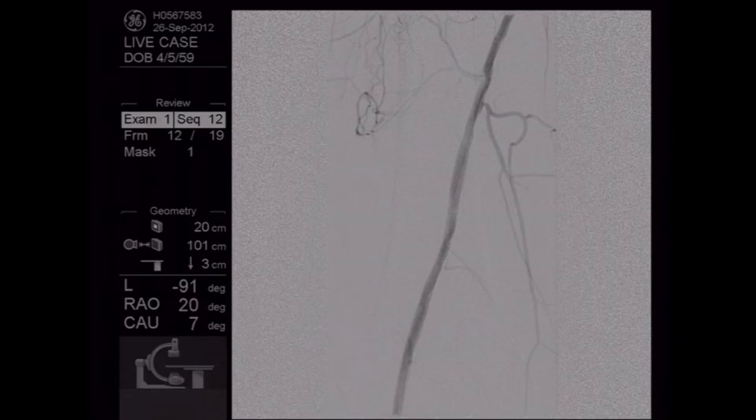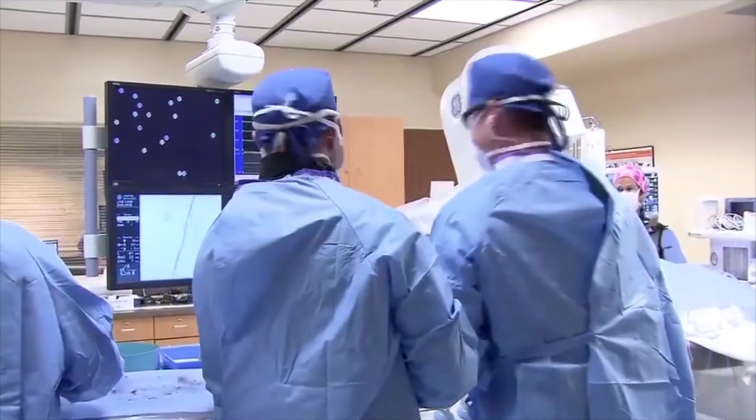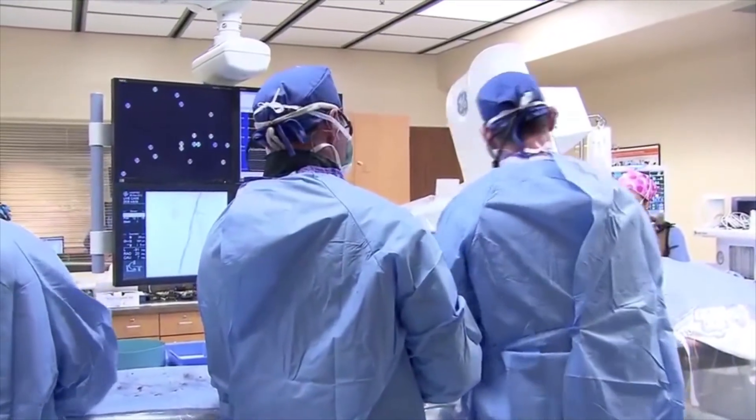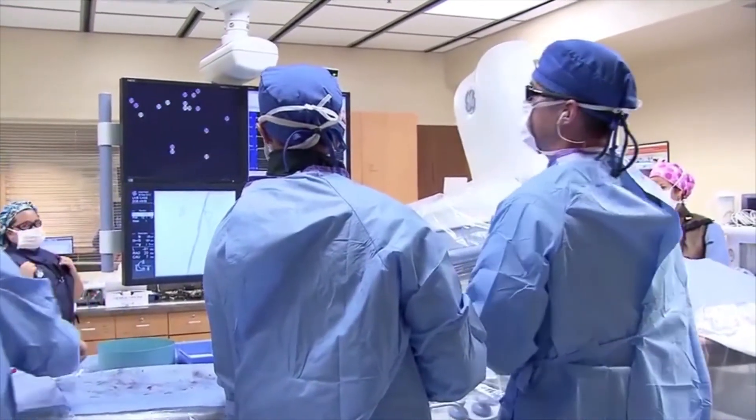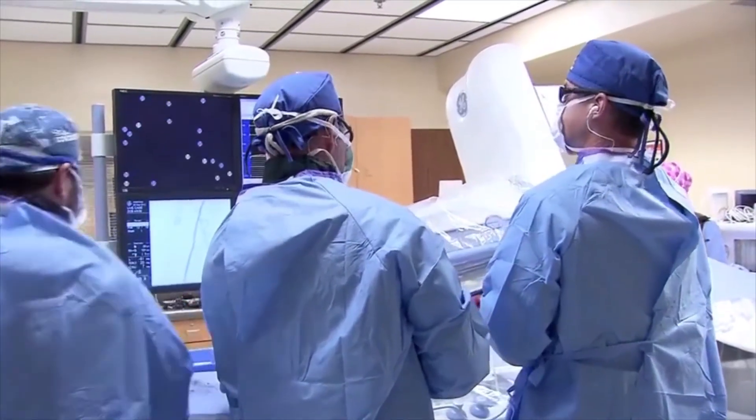One of the interesting points about atherectomy — I'm always amazed that it's really the only modality that effectively preserves or sometimes even improves the collateral flow. It actually opens up branch vessels as opposed to closing them off, which angioplasty and stenting can do. And you can see we still have very good flow in the branch vessels in that area.